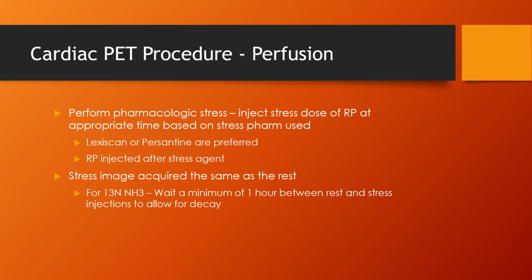That's different from SPECT. And with nitrogen, you want to wait a minimum of 1 hour between the rest and stress injections to allow that nitrogen ammonia to decay.